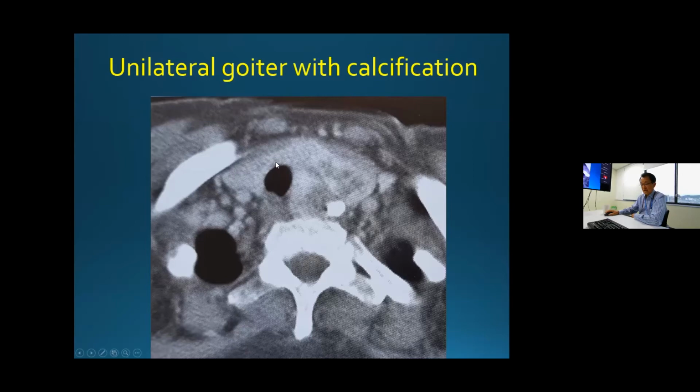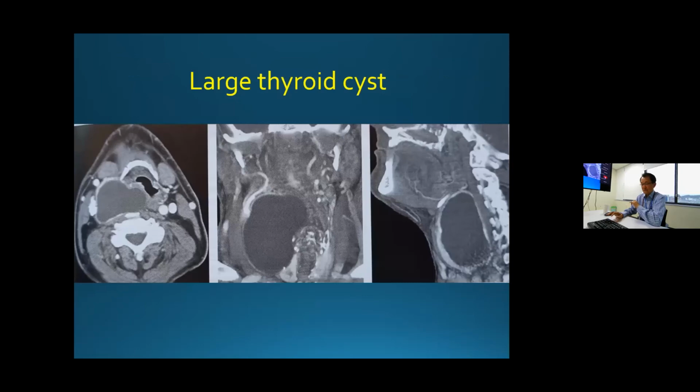Thyroid here, the thyroid is normally high density because of iodine, very high. So if there's any mass, like some nodule here, the calcification is usually related to previous bleeding. And then right behind the superior and inferior poles of the thyroid is a tiny parathyroid. Now this is an old slide, but new CTs can show very fine structural information. So easy.